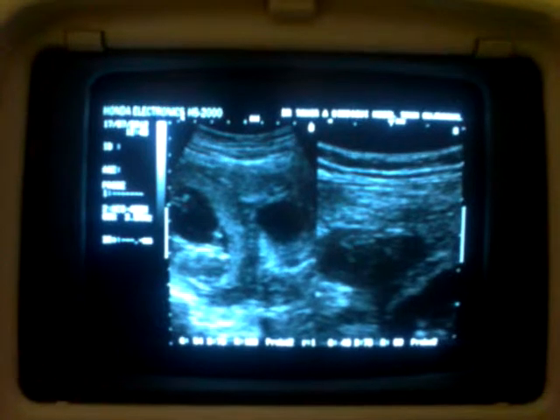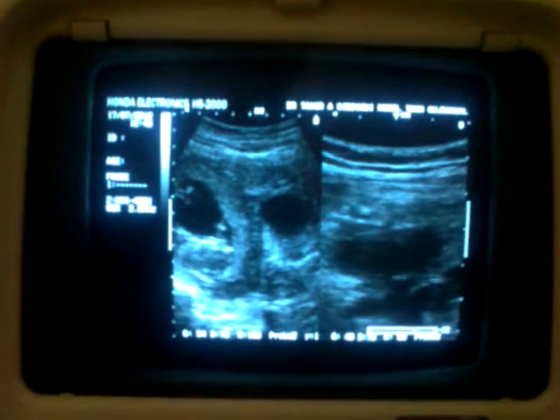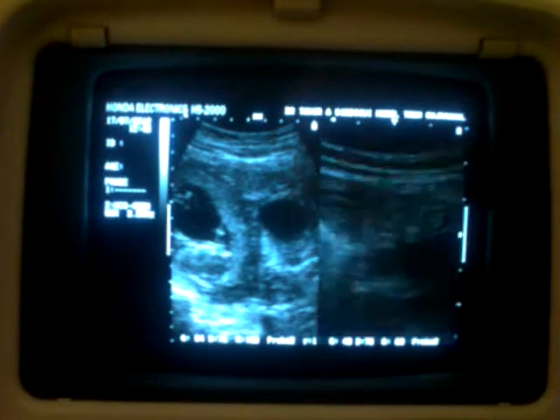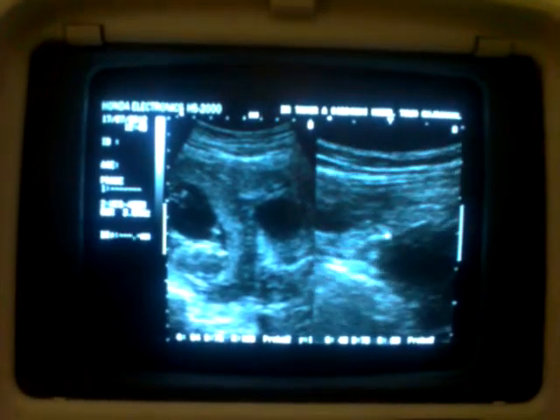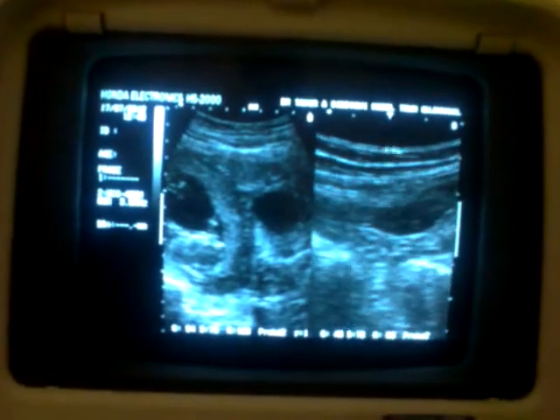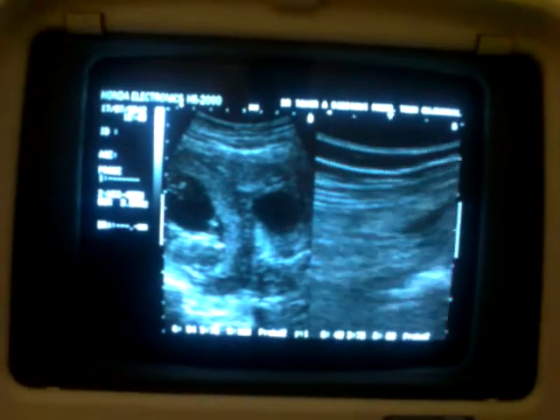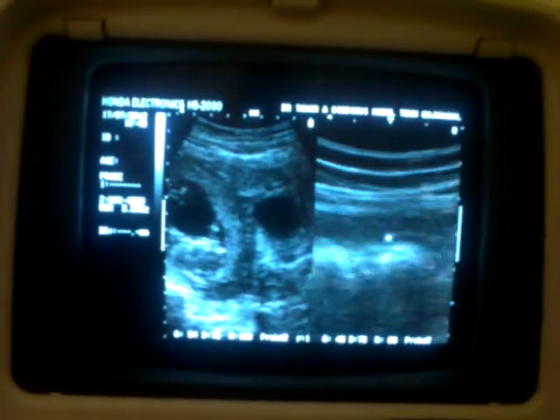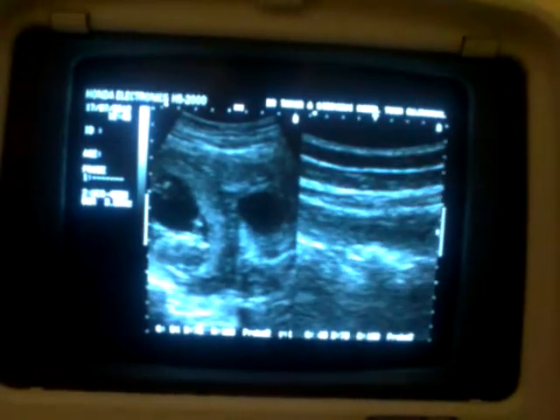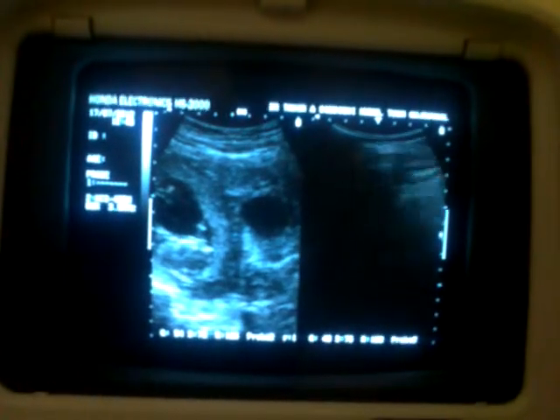This is the third one. And from here, you see this is the fluid now behind the anterior abdominal wall, and travels all the way into the hepatorenal angle.